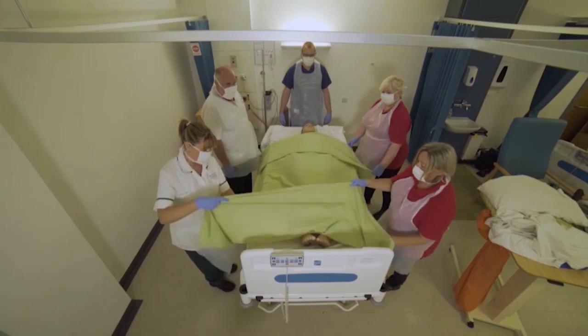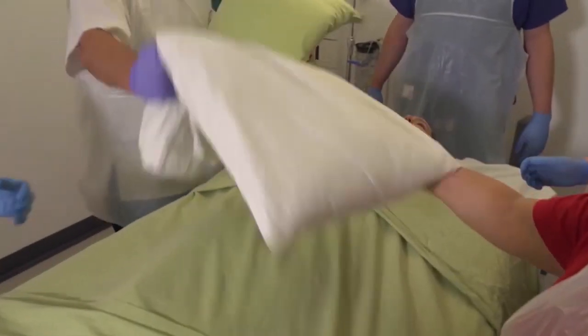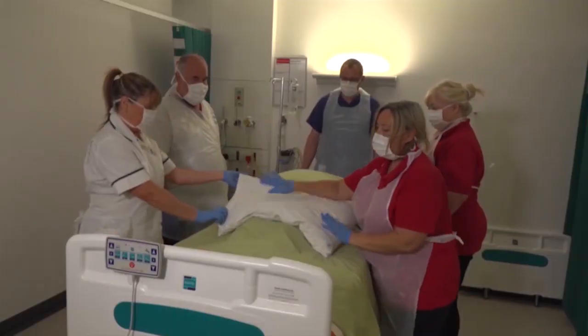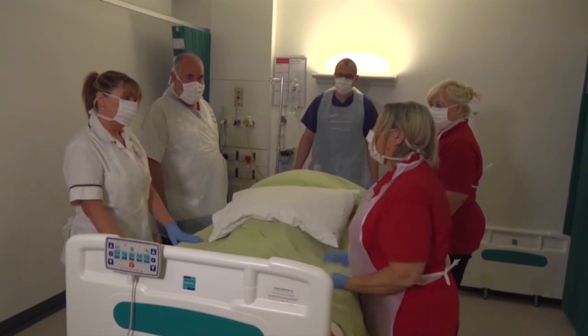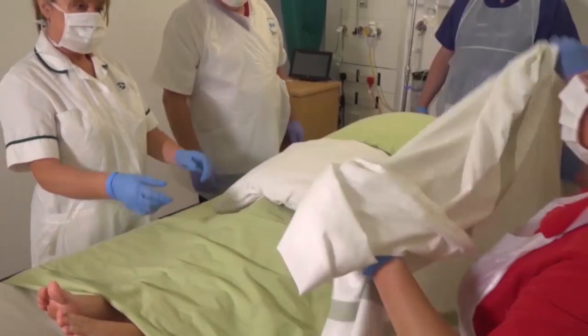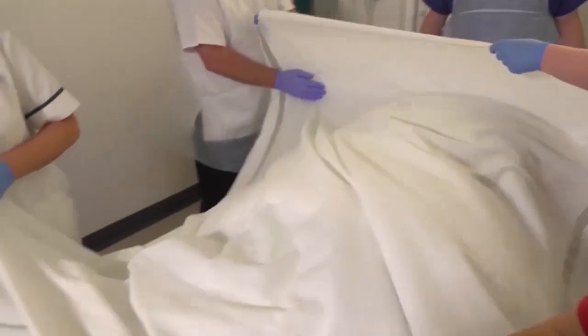We're going to fold this sheet back over the toes and then we're going to get some pillows — one at the chest, one at the hips, and if necessary, one at the knees. We're going to get the second sheet. This is vital for when we are doing an x-ray.